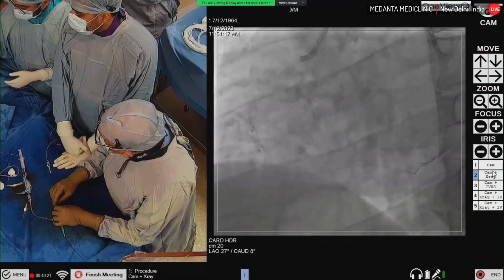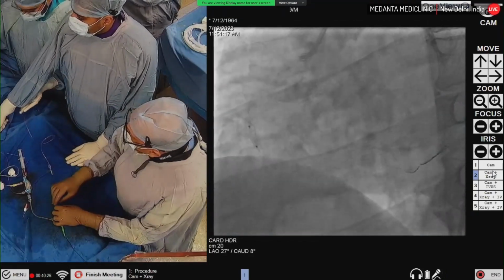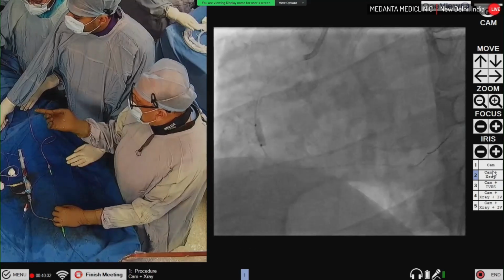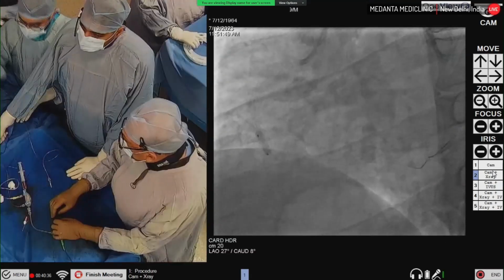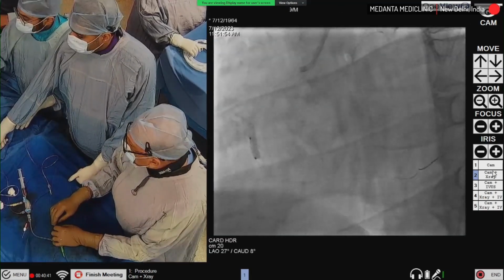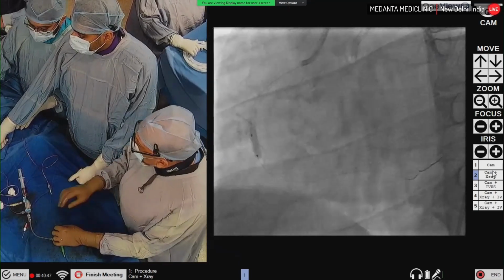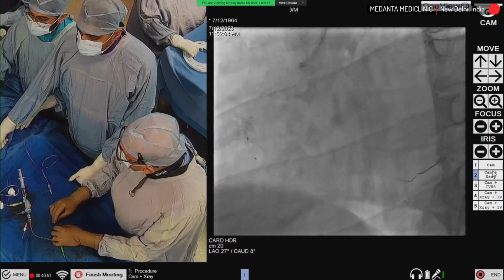Okay, so I can see on the live this thing. Okay, go up please. 1, 2, 3, 4. So there is the live stent boost. Again, this is a system which comes with this Volcano system. 4. Go up to how much? 4, 5, 6, 7, 8, 9, 10. Deflate. So it looks like we have covered the stent edge.